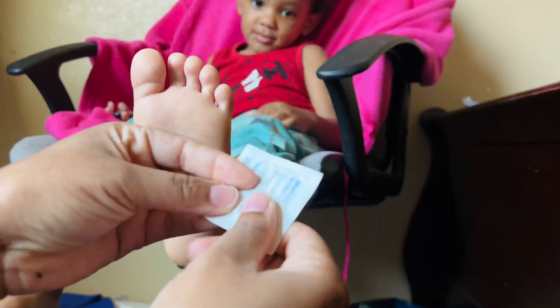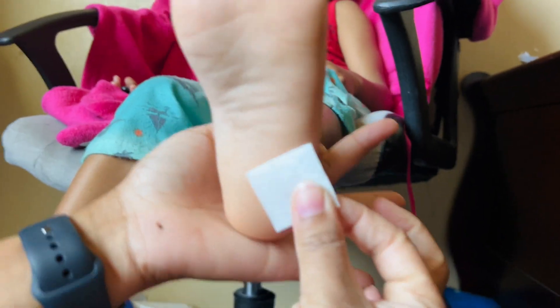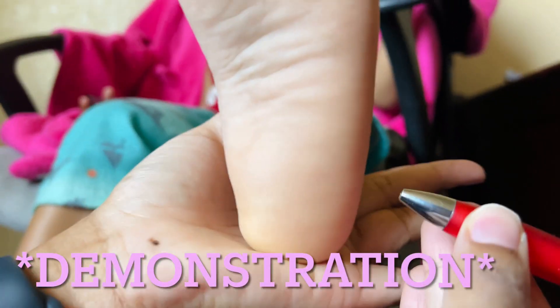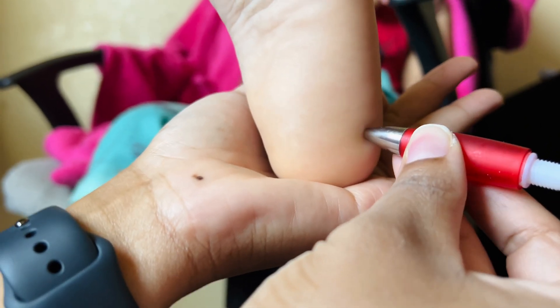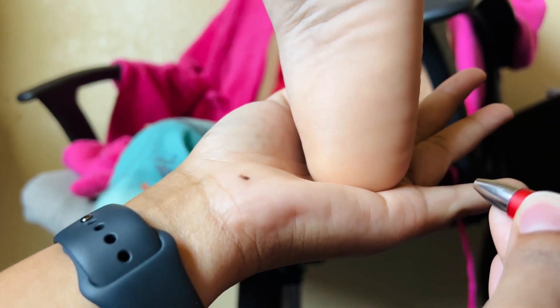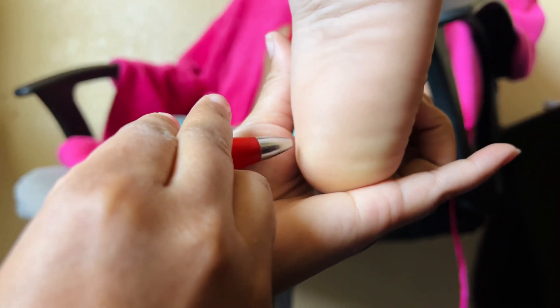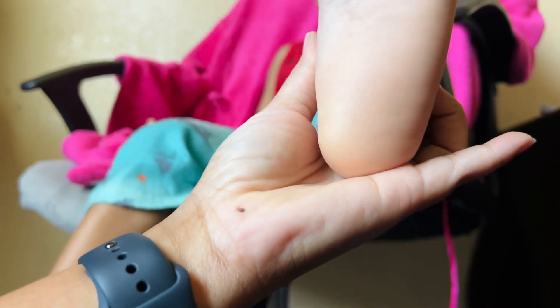Clean the area with an alcohol prep pad, wiping all around the medial, lateral, and middle part of the baby's heel. Then place your lancet onto the skin — whichever side you chose, whether lateral or medial — and press the button so it shoots. It is up to your preference which side you feel comfortable performing on.